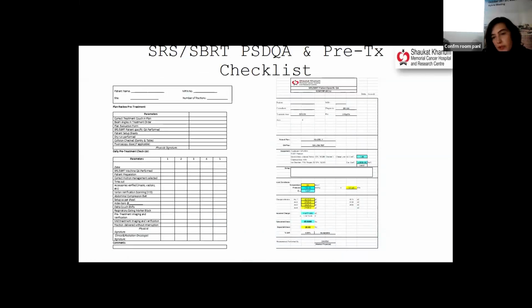These are some of the checklists. After this, the third part of our workshop is an actual demonstration of patient and machine specific QA. This is a pre-treatment patient specific QA. Like Rafi had mentioned a bit earlier, we use portal dosimetry and a point dose patient QA at the moment. We don't have an independent array system for that QA. Also, before we start the treatment, we have a pre-treatment checklist that both the therapist and physicist go over before we actually start a treatment.